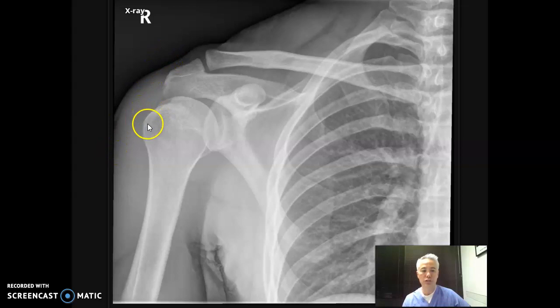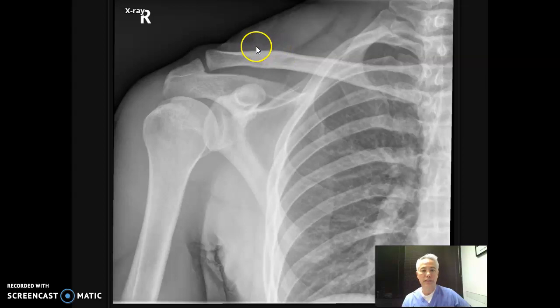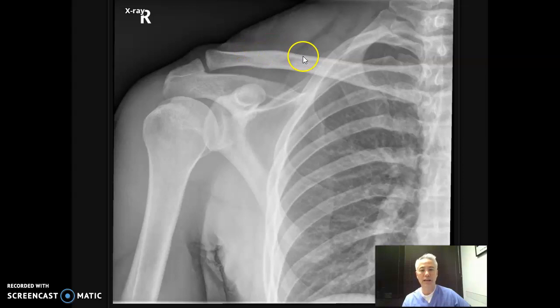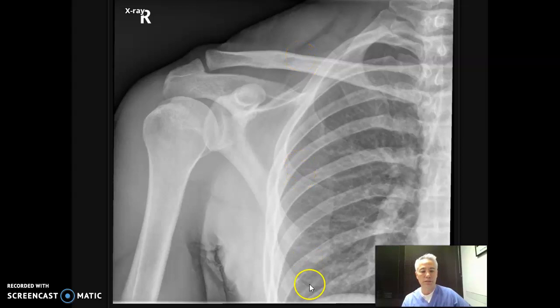Top to bottom, you want to go towards the top of the clavicle. Typically the most superior portion is going to be either the AC joint — right where the acromion and the clavicle meet — or sometimes towards the medial side. Everybody's clavicle is shaped a little bit different, but mostly it goes towards the outside. Sometimes the most superior portion is going to be the superior angle of the scapula. Inferiorly, what you want to see is the inferior angle of the scapula — this is the lowest point that should be on there. You don't need anything below that, but you do need the tip of that scapula towards the bottom of your image.